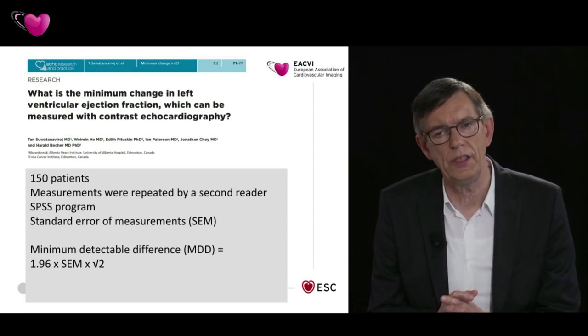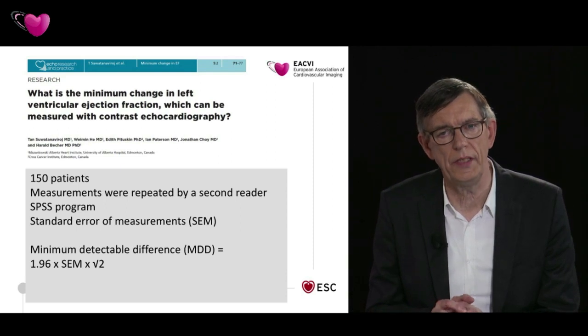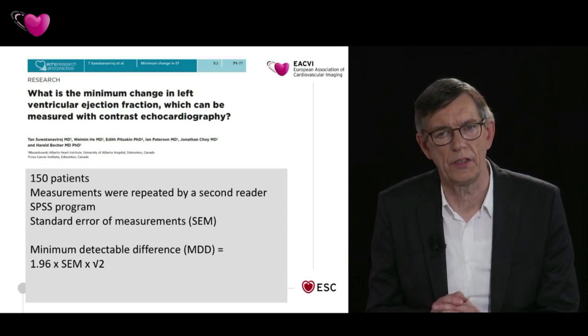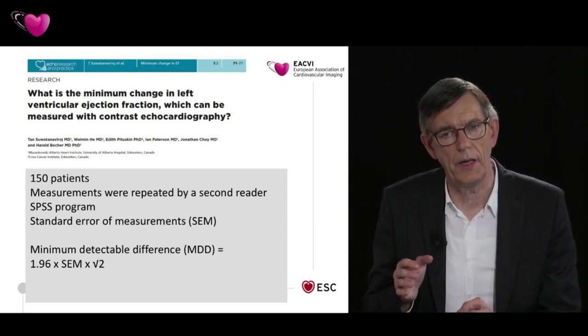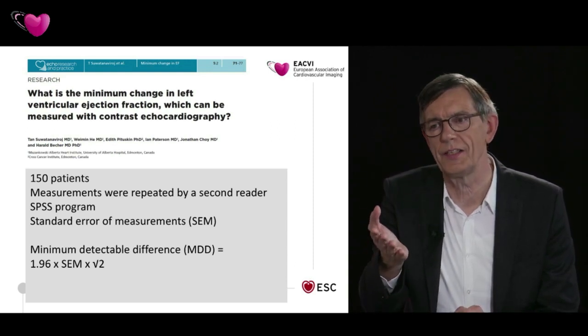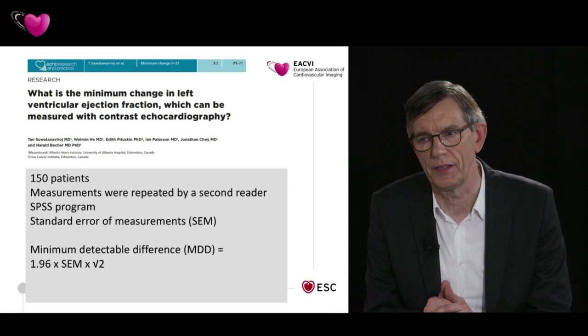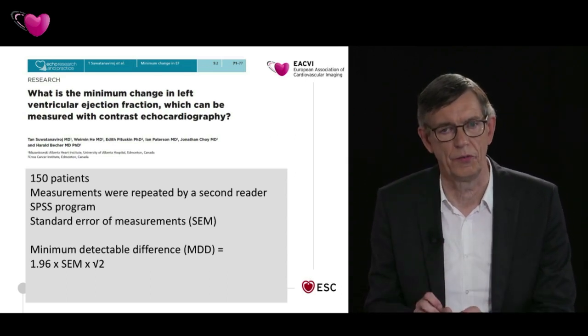It's not so difficult to do that. We just repeated the measurements in 150 of our patients. To be very honest, in this study we only included patients in whom we got recordings that met all the criteria presented by Dr. Helfen and all the quality markers I have presented so far.